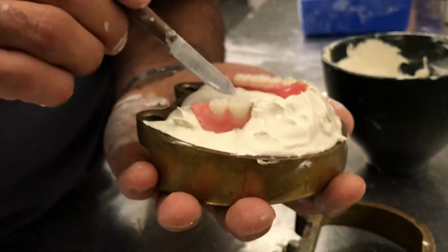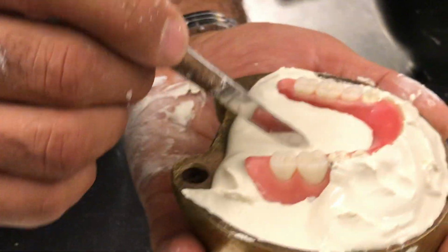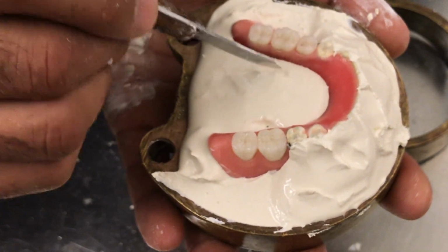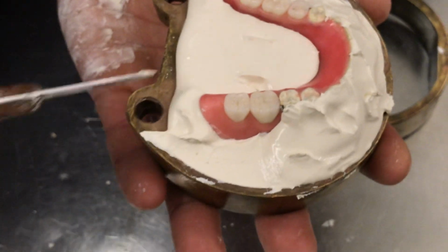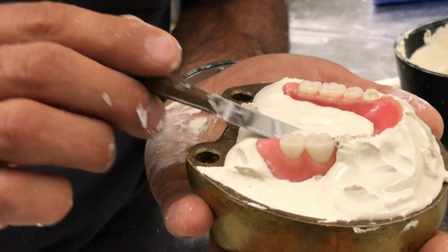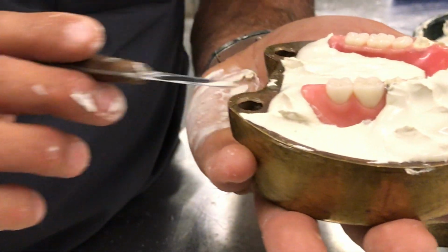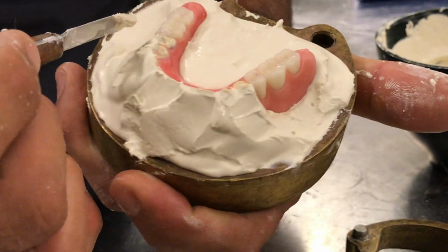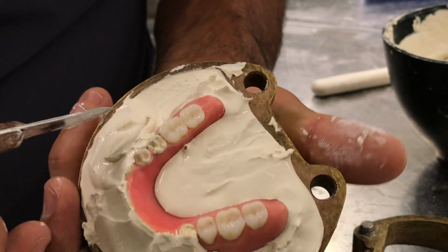I got a little bubble coming through here, but it seemed to have settled out. Nope, it's still there. Just tapping the little extensions here. For some reason I'm getting a little bubble here. Just trying to cover. Take a little bit of stone here and apply it to here.